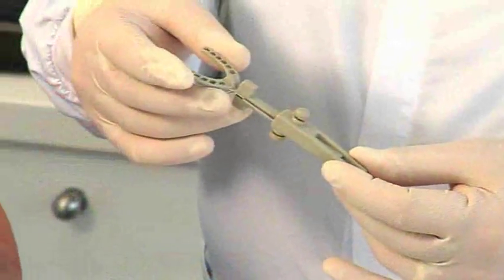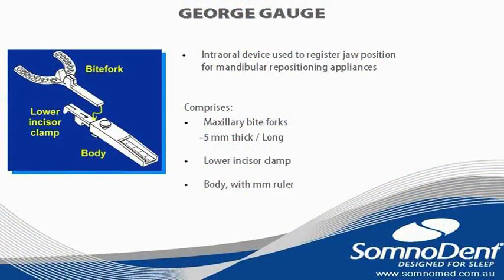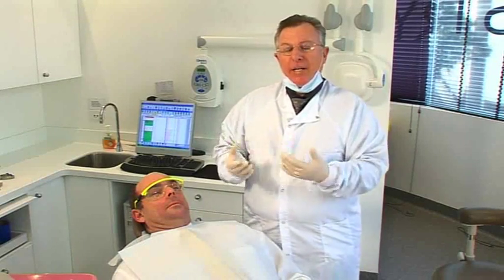The device that I prefer to use for accurate and reproducible protrusive recording of the mandible is called the George Gauge. We're about to take a protrusive record of Simon's mandible.